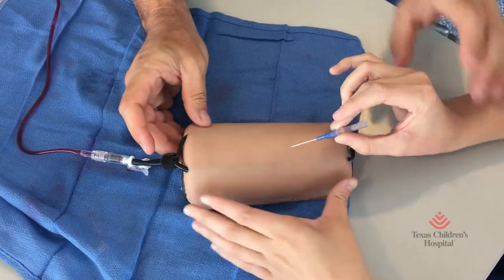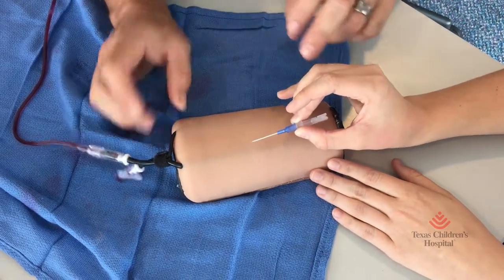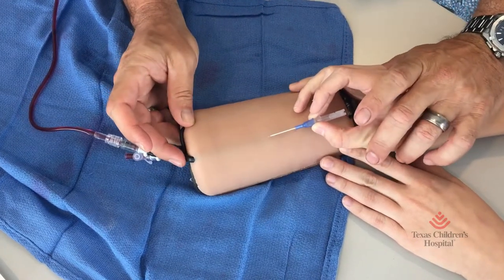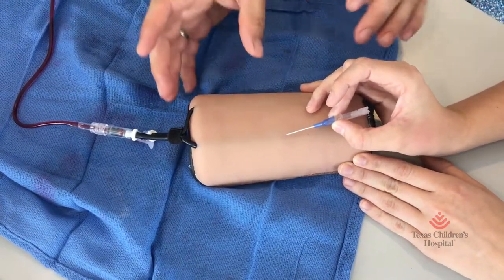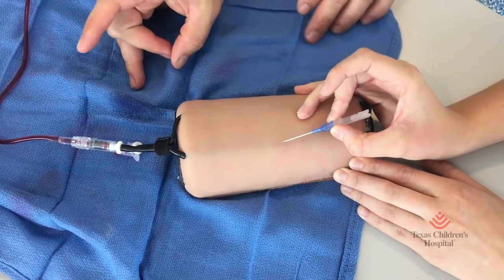Pull your patient up to you, get control, or move your arm forward. Then find your vein — you're going to anchor up against your patient with it. It should be like that, and you can move like this if you want or that.